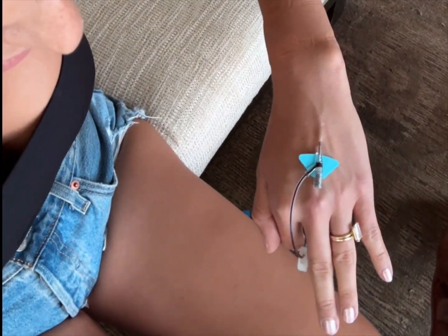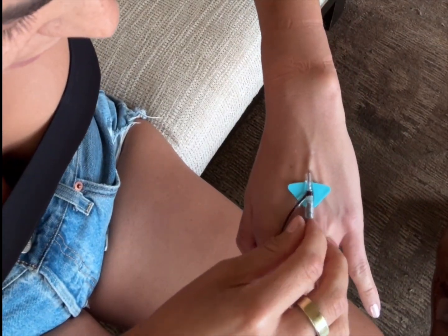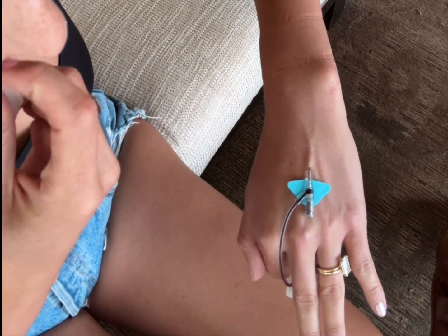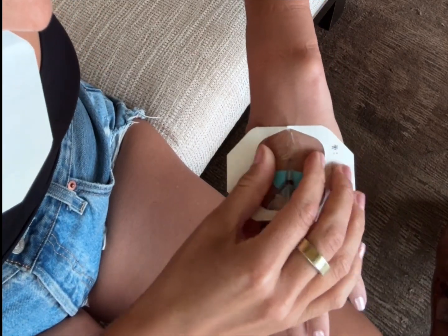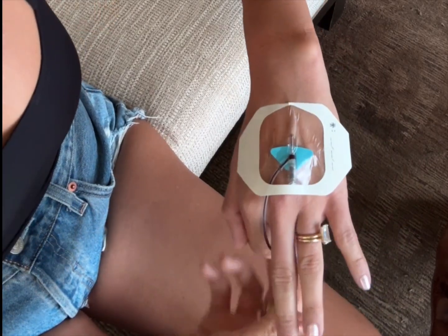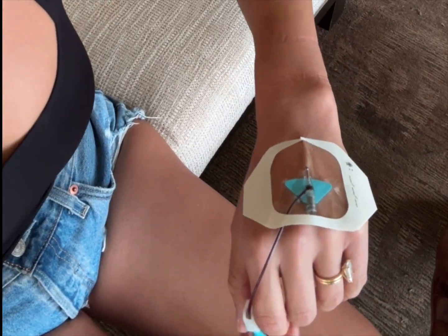Now I know I'm in. I'm going to leave a little bit of the catheter out - nothing too crazy - so it doesn't slip out on me, and then I'll attach my extension set.